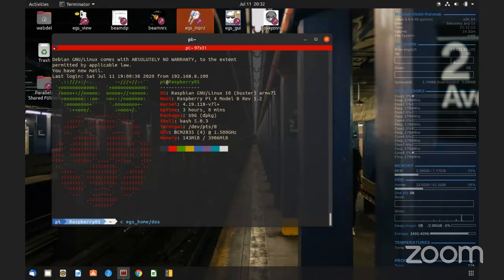I'm not sure about GPUs. EGS does not by default run the simulations on GPUs. But I listened to a talk where someone did something very crazy. He got GPU cards, I think from old Sony PlayStations, and he configured EGS to run on these GPUs, and the simulation was really fast. So maybe it is published somewhere, and you can contact them and see how they did it.